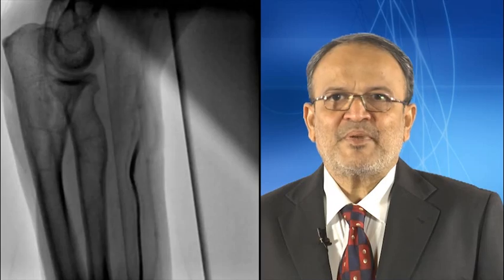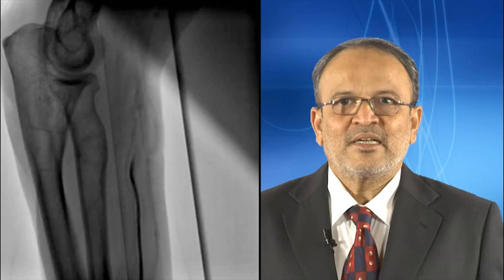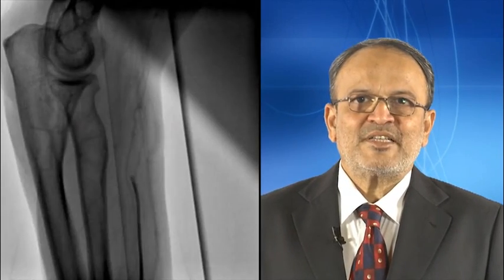We can see that the radial artery has taken a double hairpin turn. Hence, we will call this loop a double hairpin loop. It is once again being emphasized that whenever you feel resistance to the movement of guide wire or catheter in this region, it is mandatory to inject the contrast to document the reason for it. If you make this a habit, you will be able to pick up this type of rare loops. Once you identify the loop and know how to work through it, it will increase your success rate remarkably.